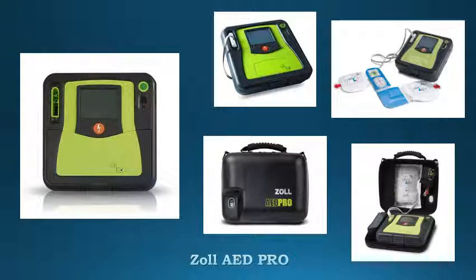ZOLL AED PRO features superior AED design and rubber over-molds are built to withstand harsh environments. Real CPR helps monitor depth and rate of chest compression during CPR using ZOLL's unique one-piece CPR-D pad. See-through CPR allows rescuers to view a patient's underlying ECG rhythm while performing CPR.